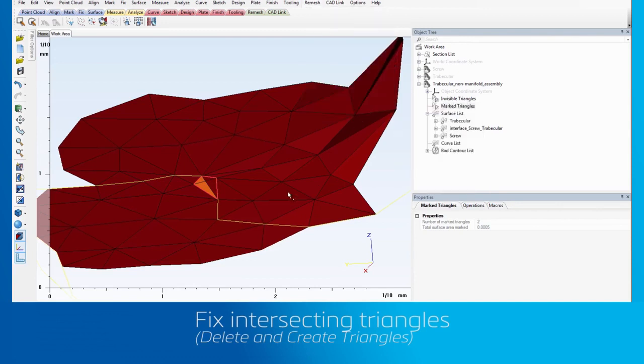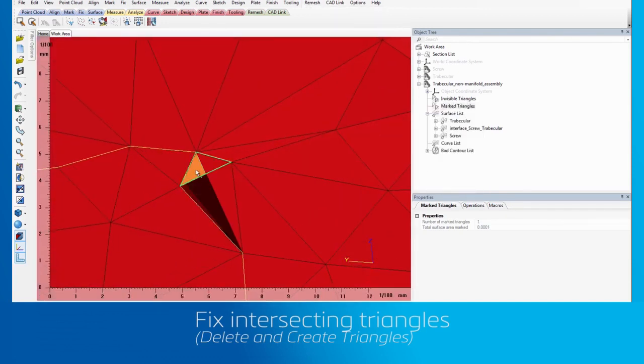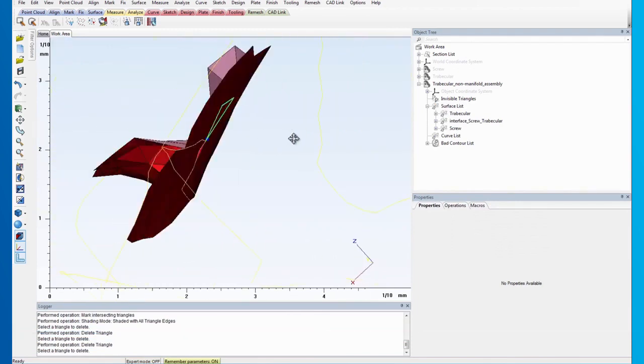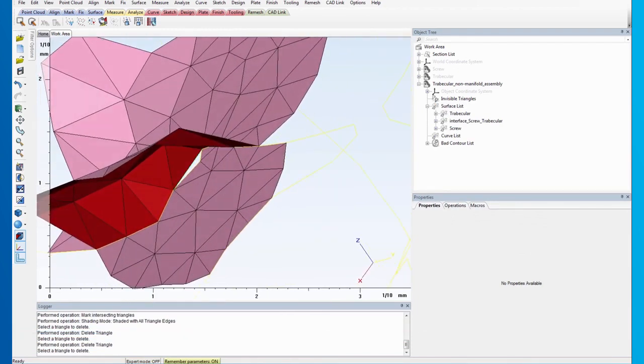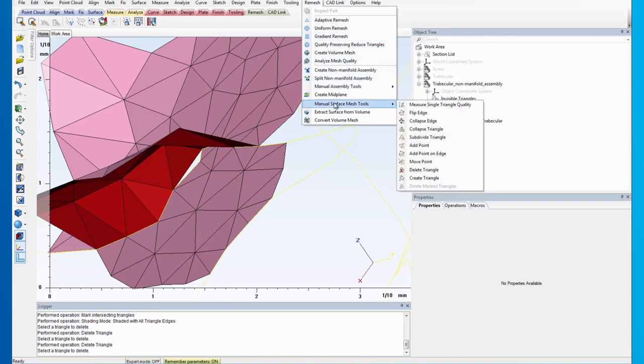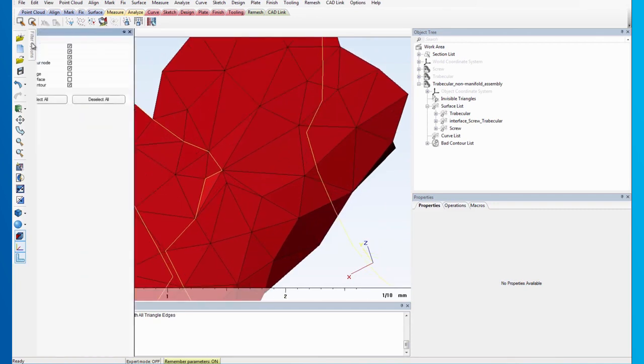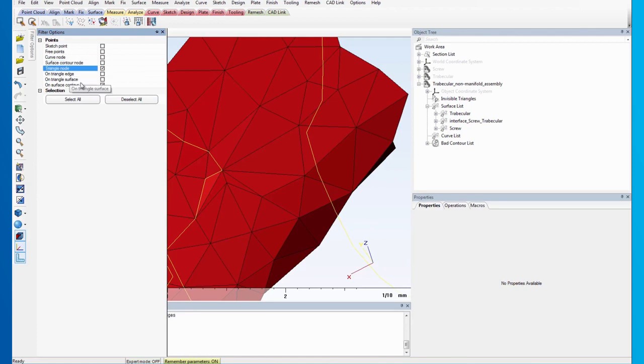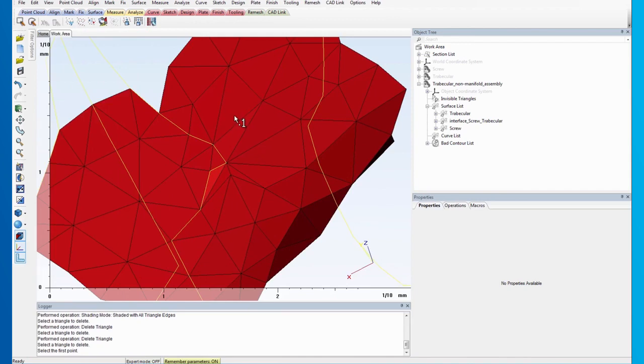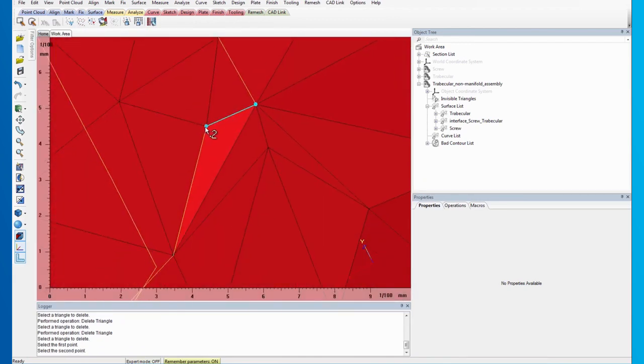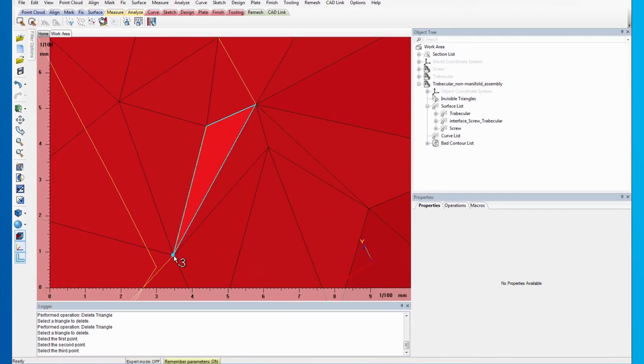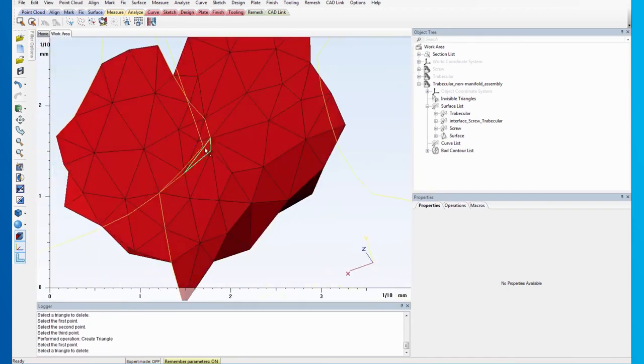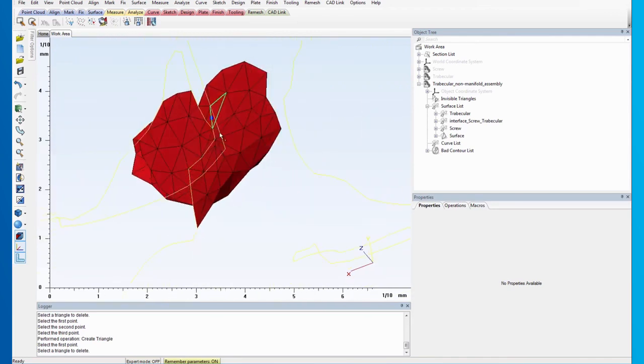Now, use Delete Triangle to delete the intersecting triangles. Then, use Create Triangle to patch the hole. To ensure that the patching fills the hole perfectly, press F3 to open the filter options. Make sure the Triangle node option is the only checked filter.